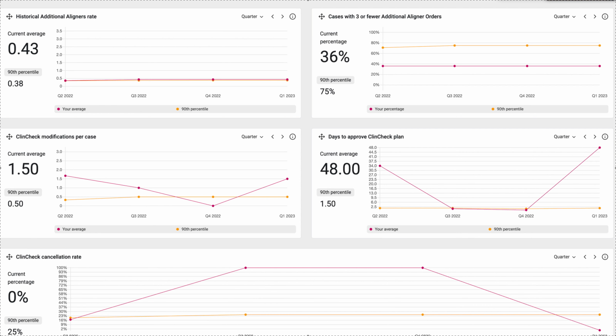All right, I have not been educated on this. I have not seen any webinars on this. I have not seen any educational materials on this. They have no explanation as to basically how this works. They just have a link that says you can schedule a meeting with Invisalign Pro to have it explained, which I did not do. But I mean, I kind of get the idea.